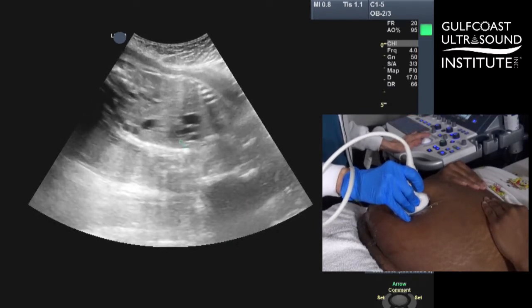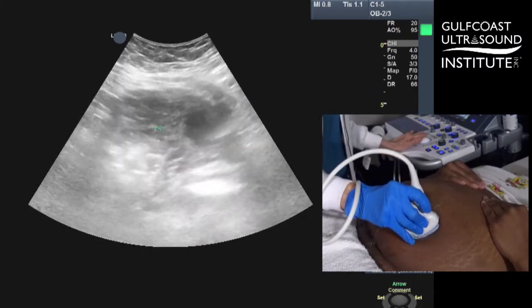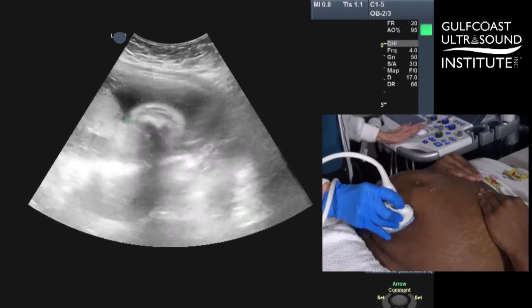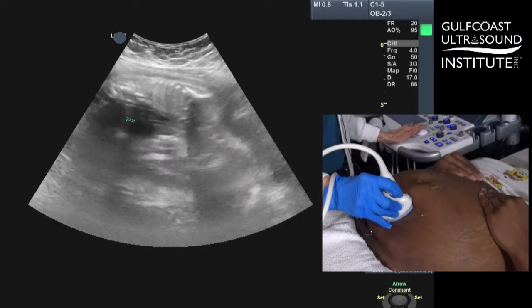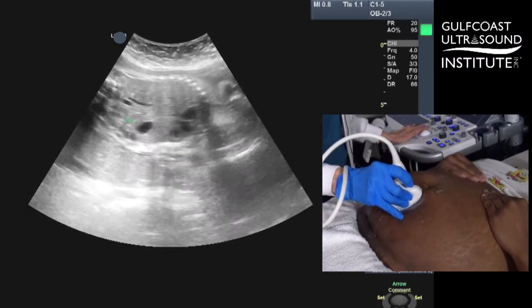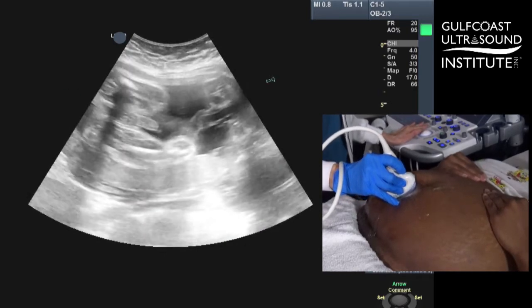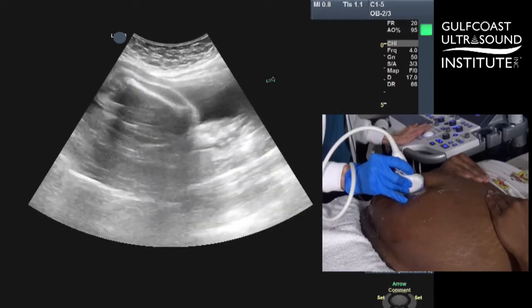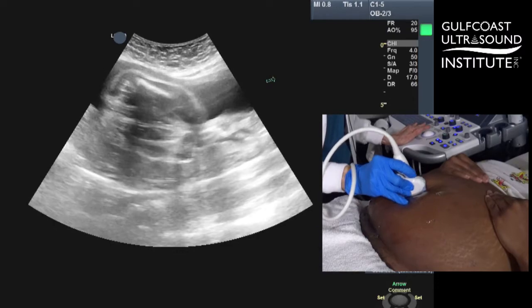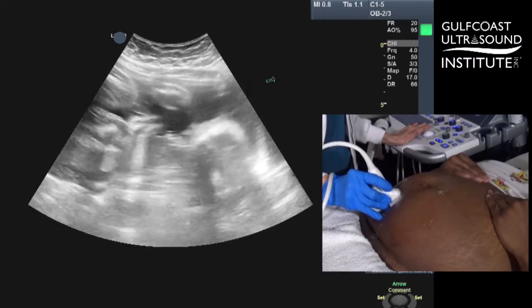Now I'm just going to keep my transducer longitudinal, sliding over towards mom's left. Basically over there all we're seeing is some fluid, baby's spine, longitudinal the abdomen. Now I'm at mom's midline and coming towards her right side. You already appreciate fetal limbs, the femurs, and the baby's arms in front of the face.